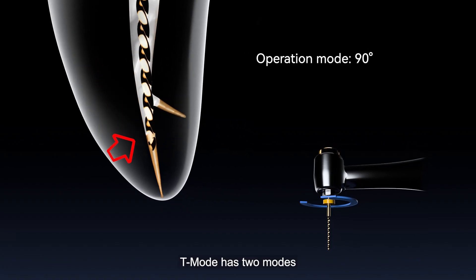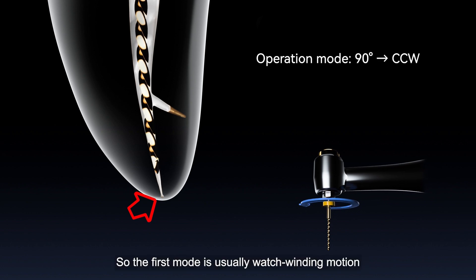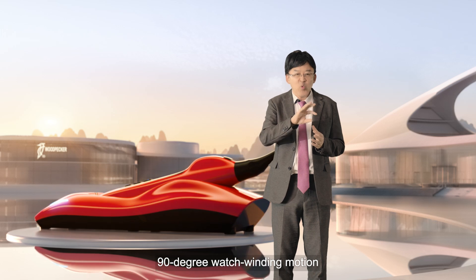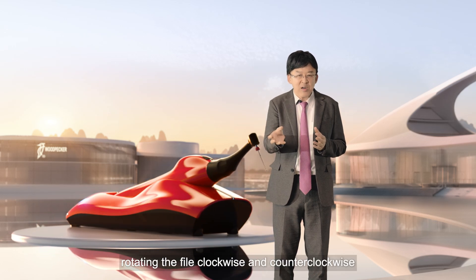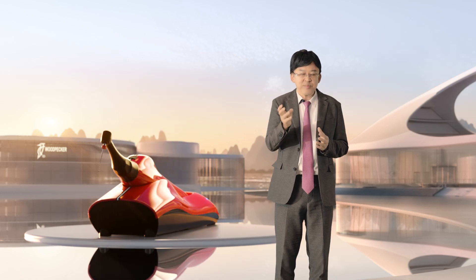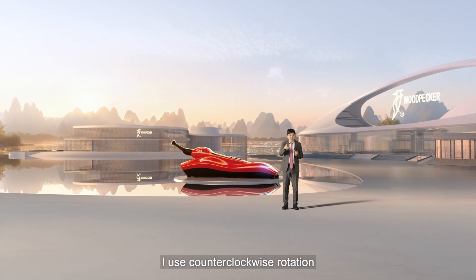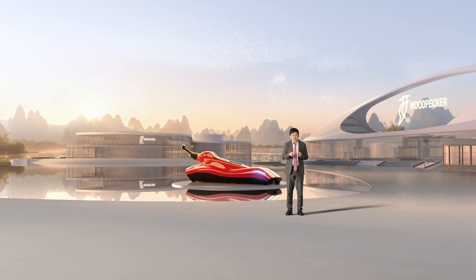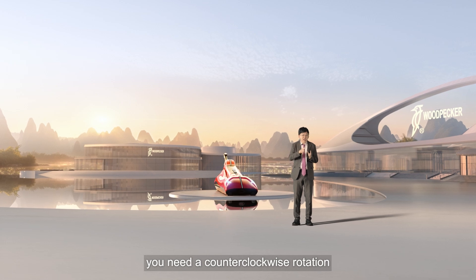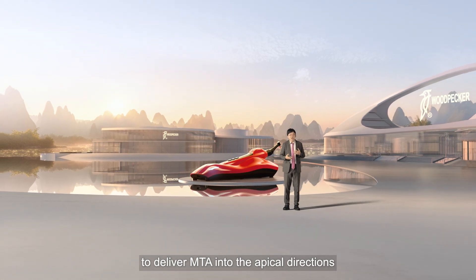T-Mode has two modes that you can control. The first mode is watch-winding motion — 90-degree watch-winding motion, rotating the file clockwise and counter-clockwise. The second mode can be whatever you prefer. Usually I use counter-clockwise rotation, because if you want to obturate the root canal with MTA, you need counter-clockwise rotation to deliver MTA in the apical direction.